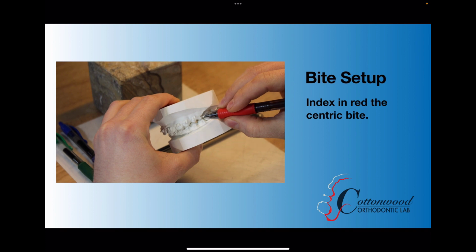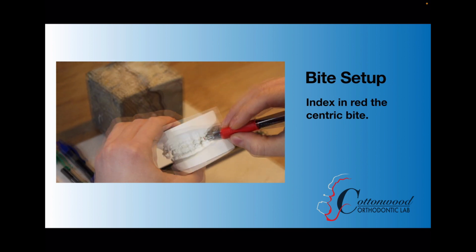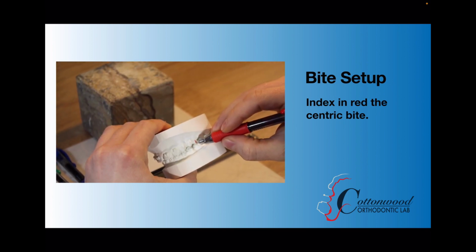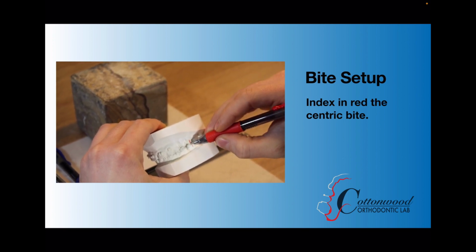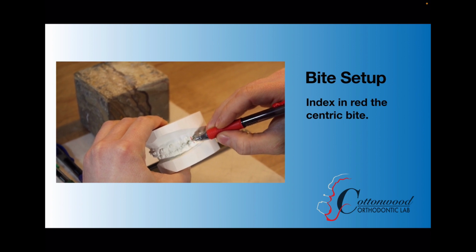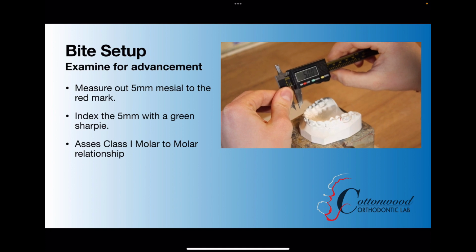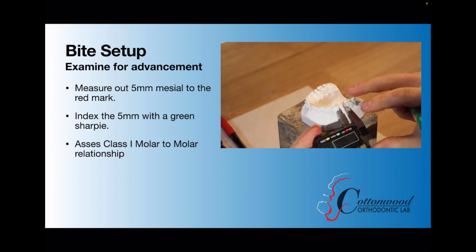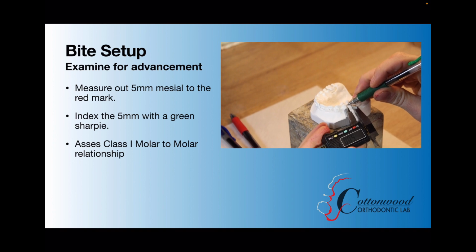Here you can see that we're going to utilize a red pilot pin to index on the second bicuspids in their centric bite relationship. This is really going to be the starting point and the judgment, and it's going to allow us to understand where we're going with this appliance in the future. So next, I want you to measure out 5 millimeters mesial to the red mark, and then I want you to index that mark on both the right and left side with a green marker or pilot pin.